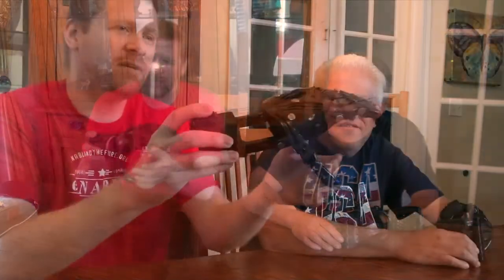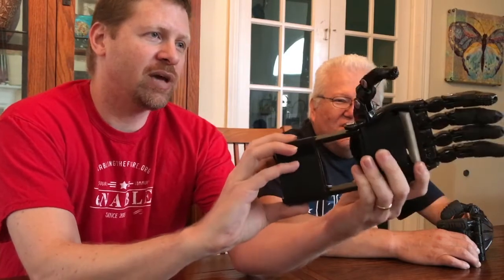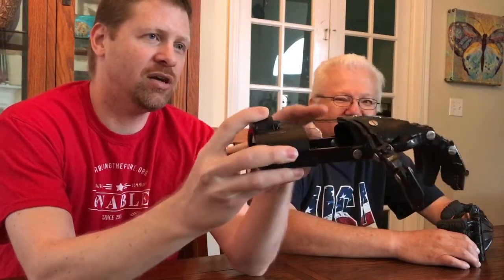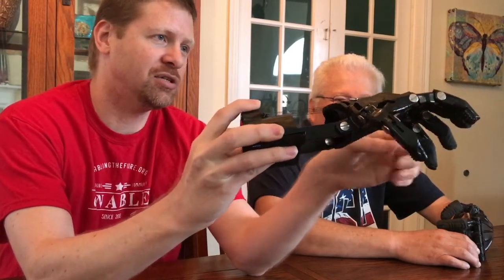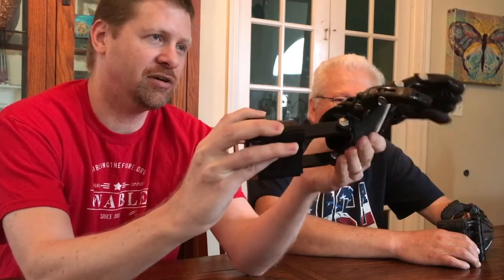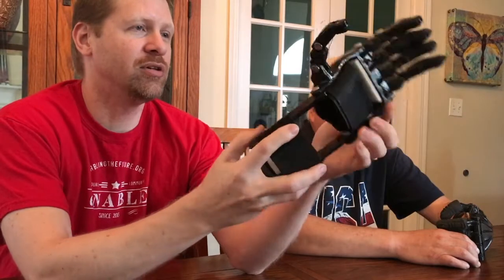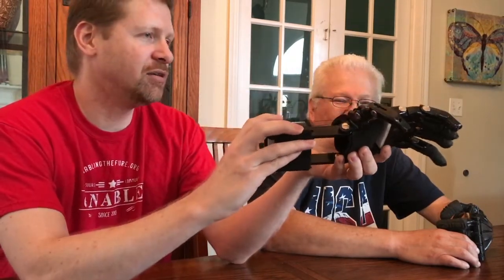I made this one here, which is a Cyborg Beast design, and I made this for him about three years ago. These are mechanical designs, so they work simply by bending the wrist. There are tension cords in here that cause the fingers to bend, and flexible elastic cords that cause the fingers to go back. It's a very simple design, no electronic components, which makes them very inexpensive to make. This one cost about $35 to produce.